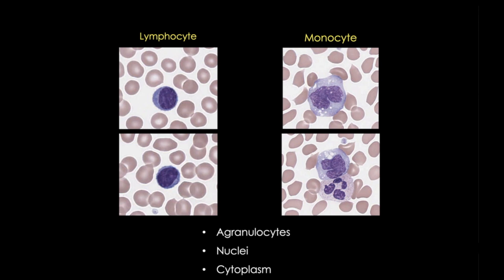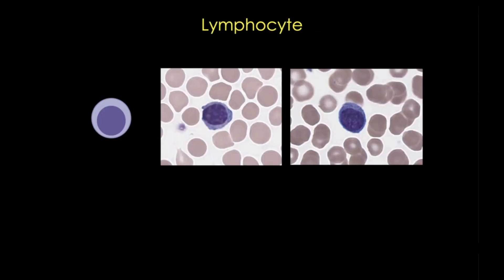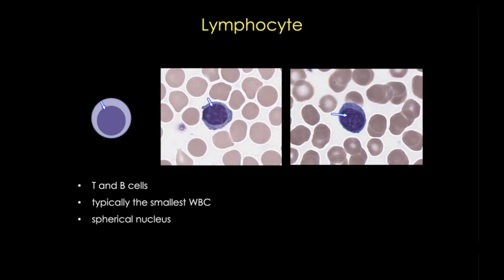Let's take a look at the lymphocyte first. Lymphocytes, which give rise to B lymphocytes and T lymphocytes, are the second most numerous white blood cell and the most numerous agranulocyte in normal blood. They're typically the smallest white blood cell. The most obvious characteristic of the lymphocyte is its spherical nucleus with highly condensed chromatin. Lymphocytes are sometimes arbitrarily classified as small, medium, and large — the small group being the most common.